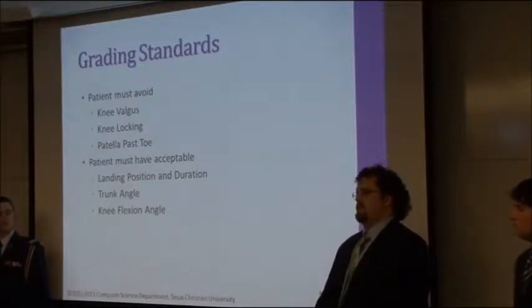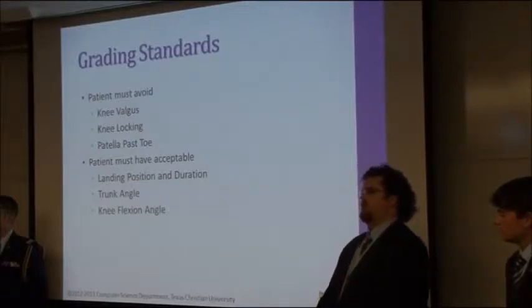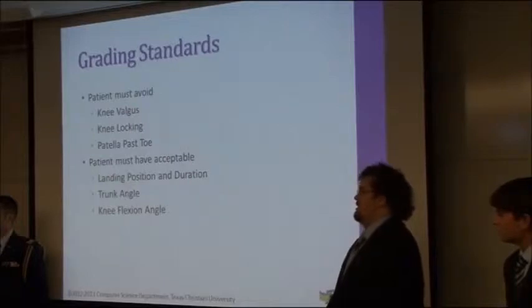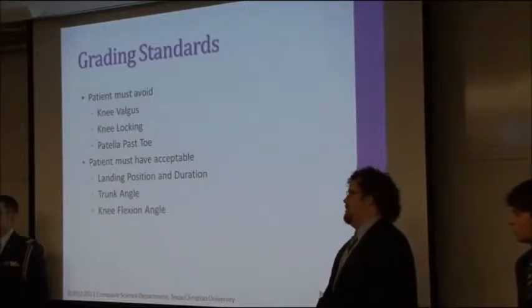Now, the standards that a patient must adhere to during the test is they must avoid knee valgus, which we'll explain shortly. They also must avoid locking their knee and letting their knee go past their toe during the exercises. They must also have an adequate landing position and duration, as well as an upright trunk angle, and achieve a proper knee flexion angle.